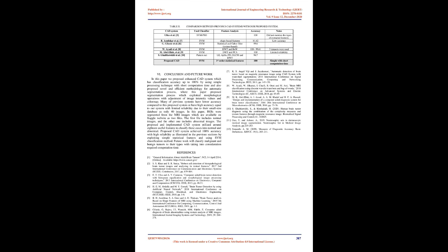Results and discussion. The proposed CAD system achieved high accuracy and reliability, where the system achieved 100% accuracy by using an SVM classifier with polynomial kernel after the proposed segmentation method was applied. The KNN classifier when k equals 1 and k equals 2 also achieved good results. Table 1 summarizes the results for the best 3 classifiers in our system, and Fig. 4 shows the receiver operating characteristic, ROC, curves for these classifiers.